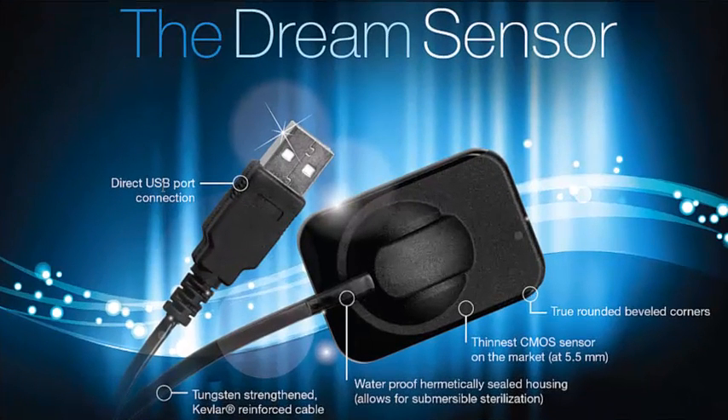Welcome to the Dentimax tip of the week. Today I want to talk about our digital sensor, what we call our dream sensor, and how it integrates completely to the Dentimax software.